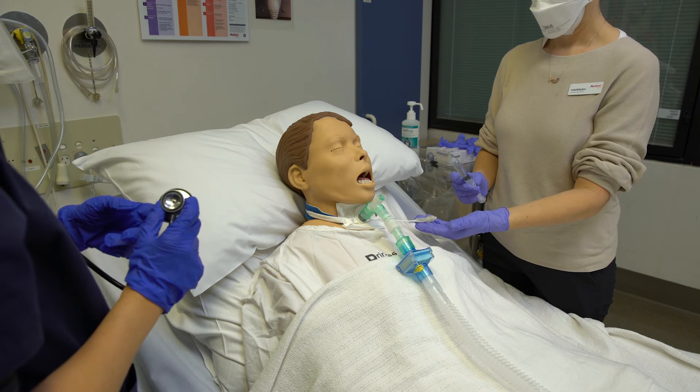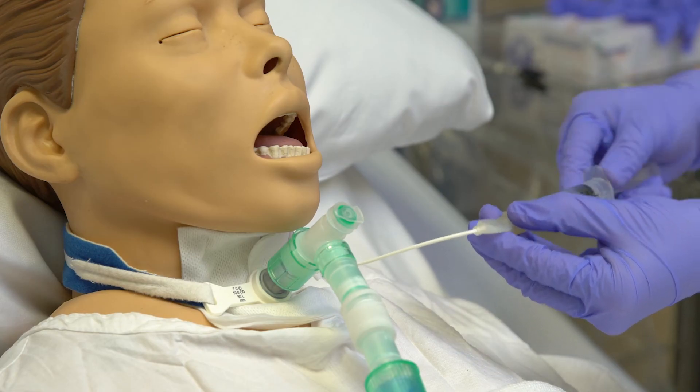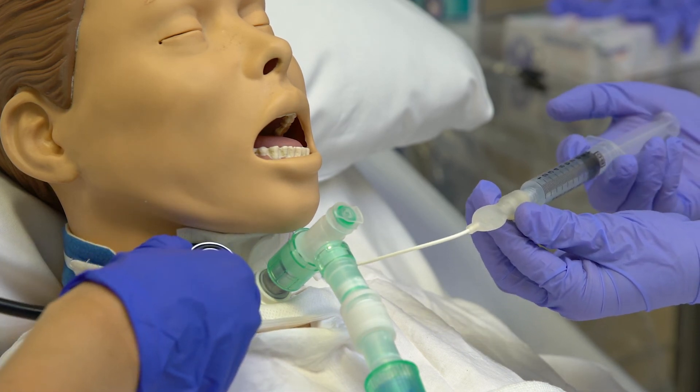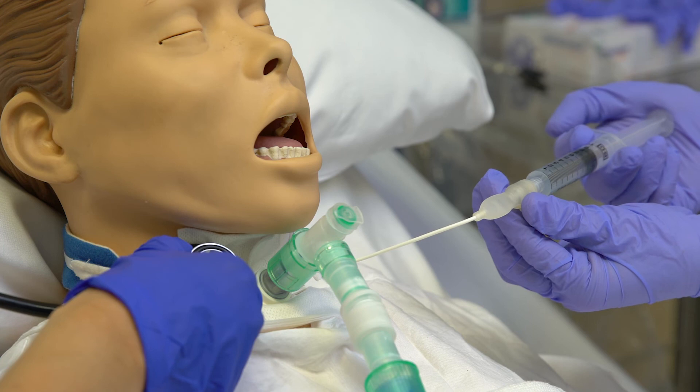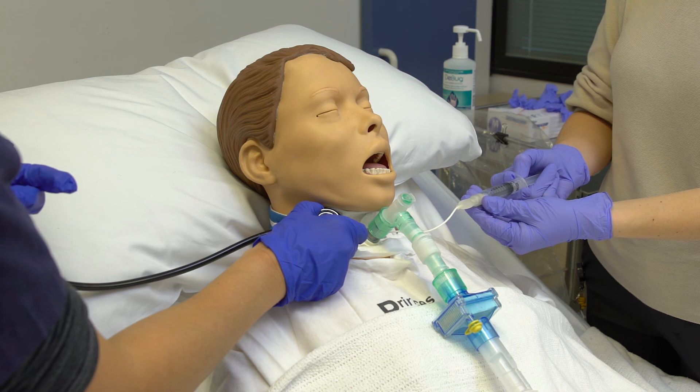Minimal occlusive volume technique for invasively ventilated patients: inflate the cuff with water for injection until there is no audible air leak in the upper airway. Use a stethoscope and listen on the side of the thyroid cartilage, or inflate until there are no voice sounds present.